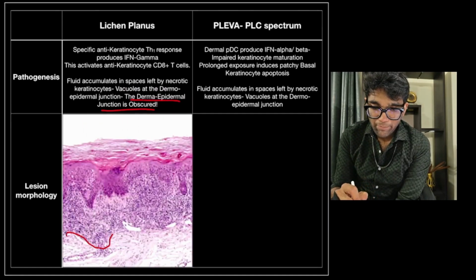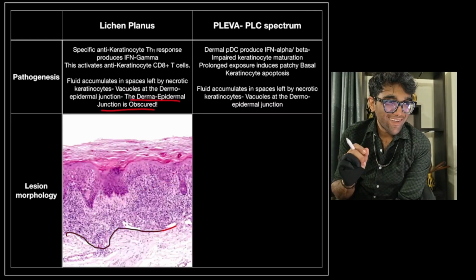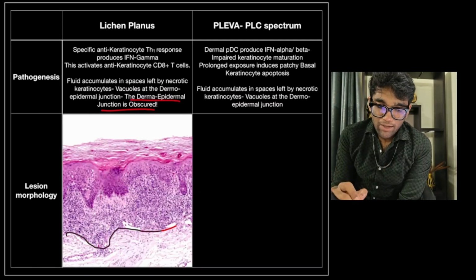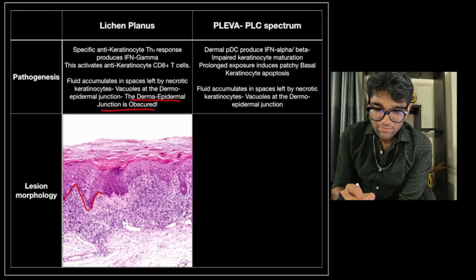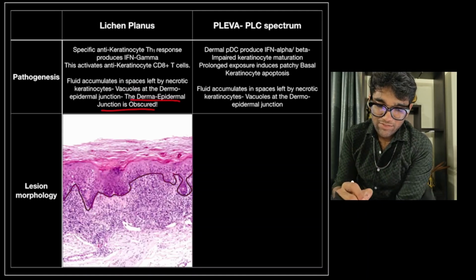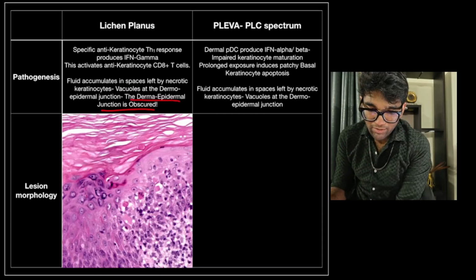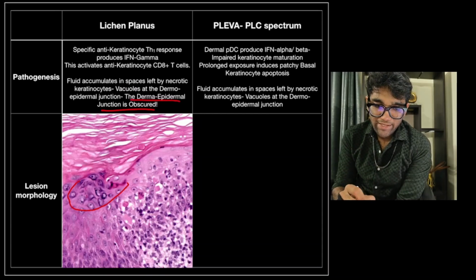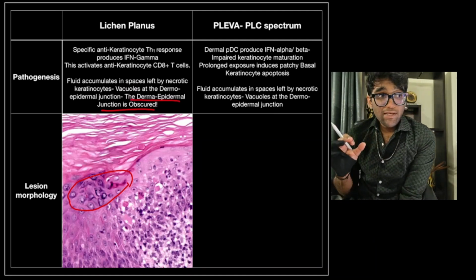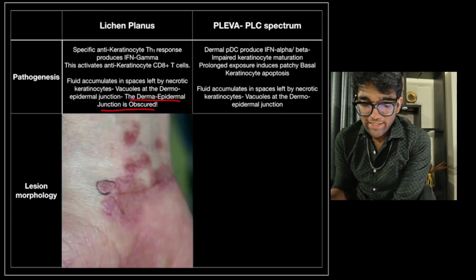There is a superficial subepidermal band-like infiltrate of predominantly blue, basophilic cells, which are obviously likely lymphocytes. The general pattern of the dermoepidermal junction is still visible, but it is not very clear, it is getting obscured. Okay, and if you take a more enhanced view, you find that there is an increase in the number or the size of the granular cell layer of the epidermis. Okay, so that is there, and this is what the lesion would therefore look like.